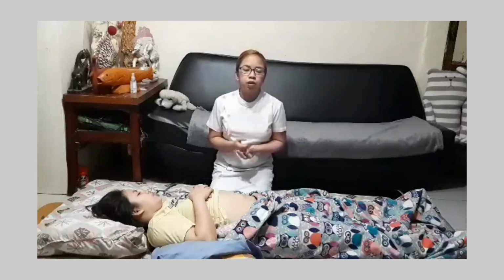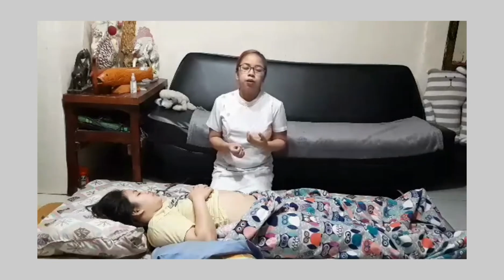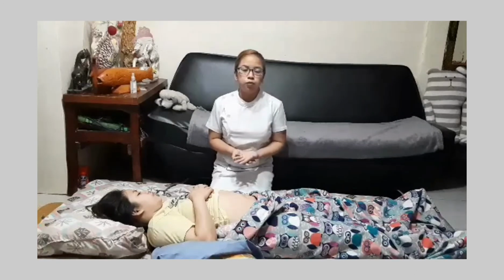Ma'am, the things I'm going to need are the stethoscope and, if you have it, the Doppler. If you have a Doppler, you will have to lubricate it first, then listen for the heart tone, and after that you're also going to count the heart rate of the baby. The average is 120 to 160 beats per minute.